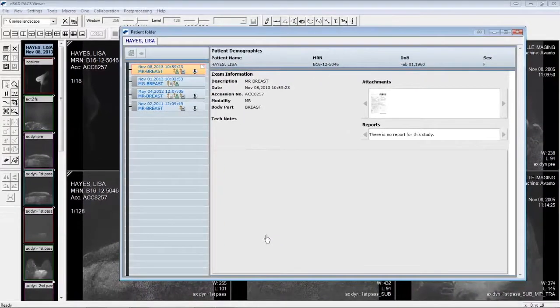This feature allows the user to see details about the patient history, including a list of prior and future orders, prior studies, technologist notes, reports, scanned documents, and demographic information.